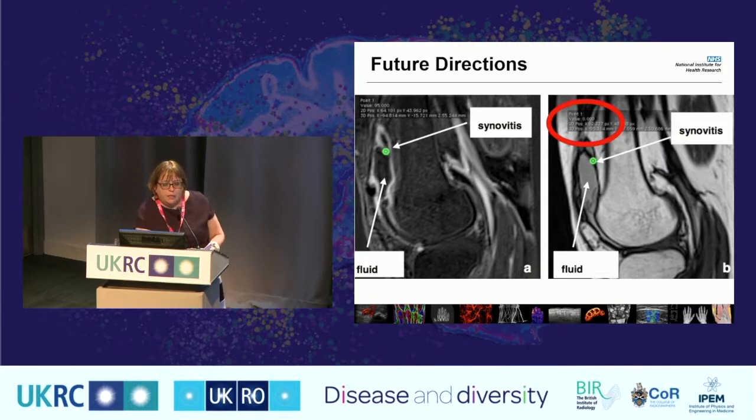So anything that has a T1 value of 1005 has been completely inverted in this image and hasn't given me a signal. So it's not just me saying this is synovitis or this is muscle. It is synovitis because that is the only structure within the knee that gives us that T1 value. Inversion recovery images only take 4.5 minutes, as opposed to the 25 minutes it took me to do my T1 measurements. So all of a sudden, we come into a clinical range where potentially we can bring this into our clinical world.